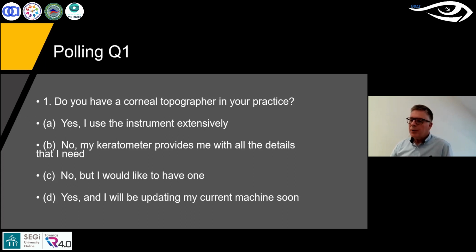all the instruments that I'm going to talk about from here onwards are very, very simple instruments. They are the basic Placido type topographer. In the hospital, we have a couple of very advanced instruments. We have the Pentacam, which the ophthalmologists use all the time and I use occasionally.